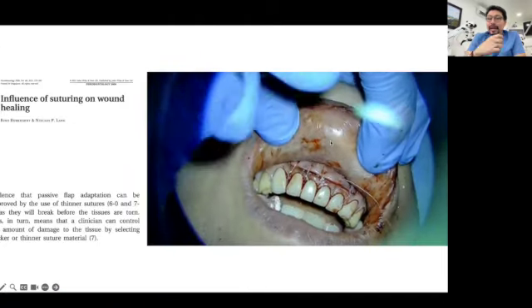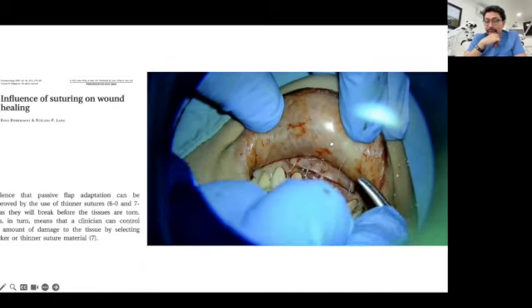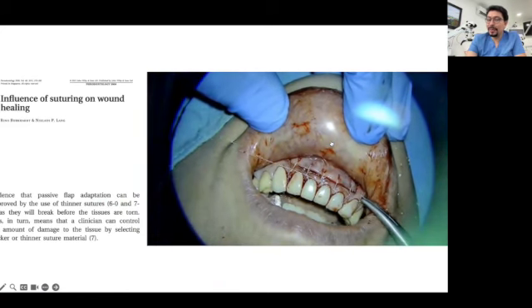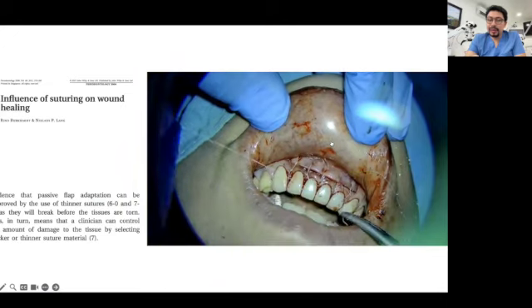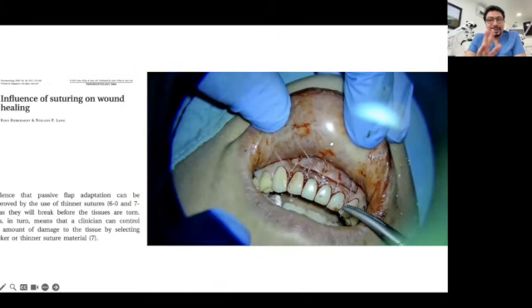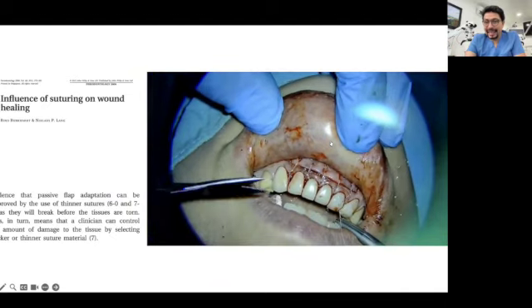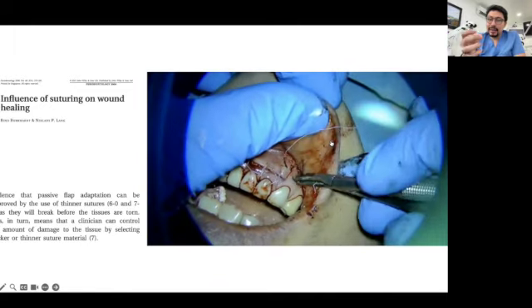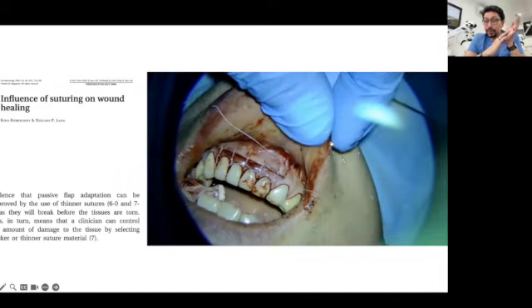It also helps in the healing of the soft tissues. The periodontists are using the microscope. Why? Because with the help of magnification, we use 6-0 and 7-0 suture. And it has been demonstrated that the scarring that can be present in the area is related to the ability of the clinician and is related to the tension that we place in our suture.